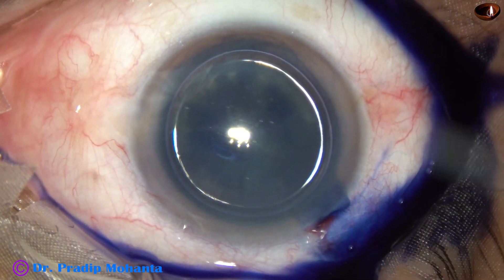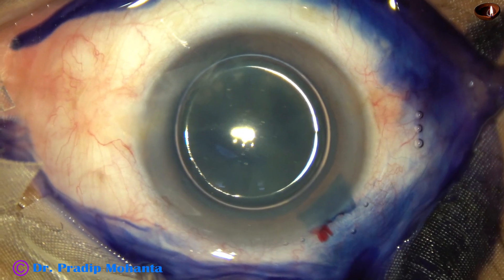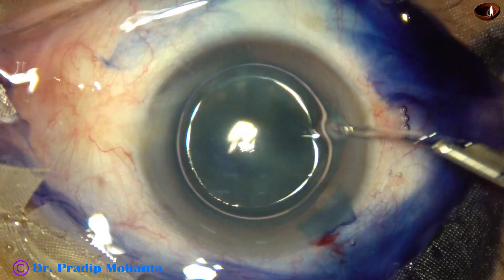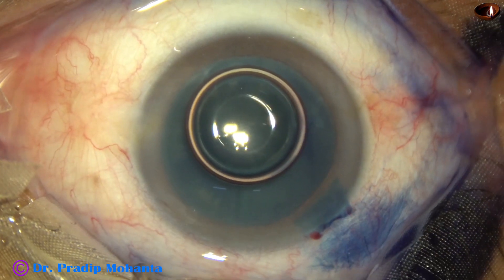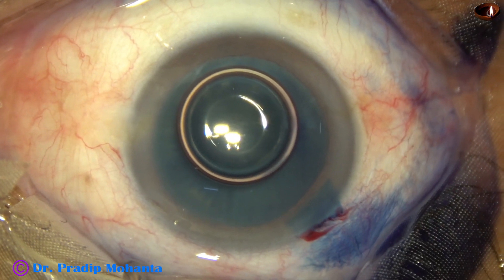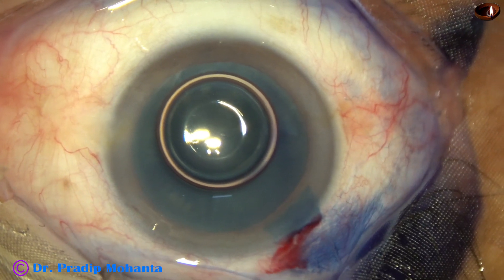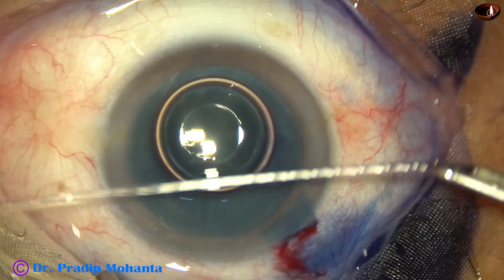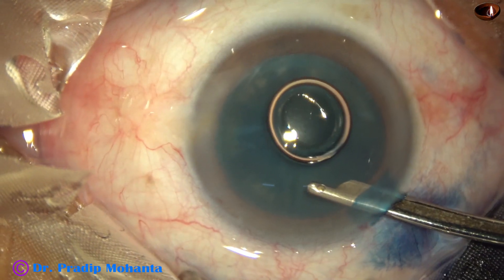If we apply Trypan blue dye underneath an air bubble, the staining is very nice and it takes shorter time to stain the anterior capsule. We should also wash the dye out, because otherwise the dye mixes with the viscoelastic and visibility is not so good.